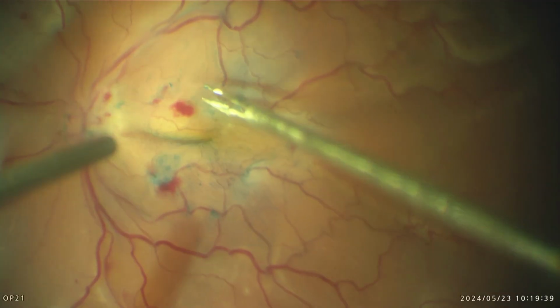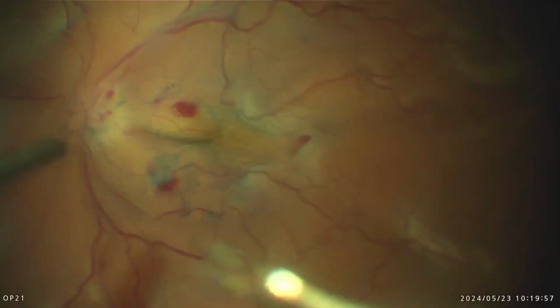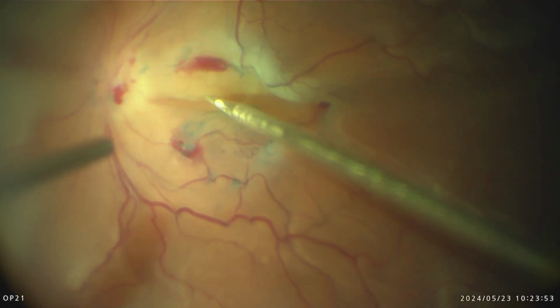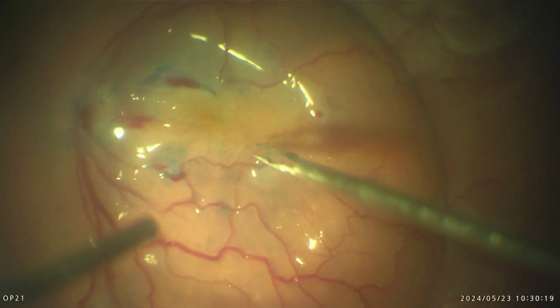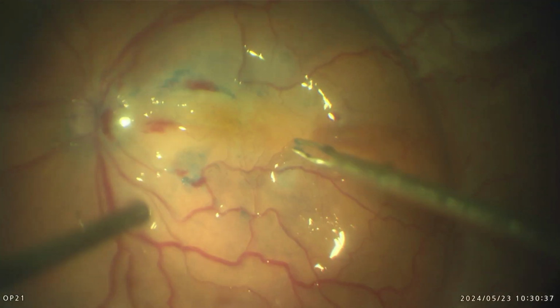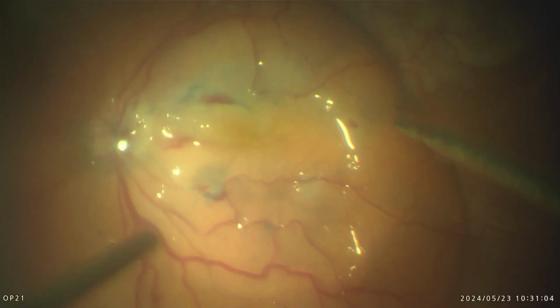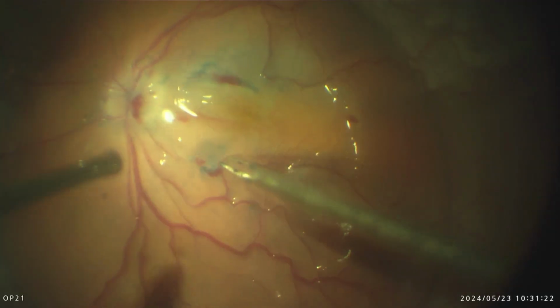So I do manage to peel off that ILM eventually, just to reduce that increased rate of secondary macular edema later on. This is a case that will need retinectomy, as you'll see later on. So I try to stay in for additional time, do some more peeling under perfluorocarbon, but not much to peel here. It's very friable ILM.